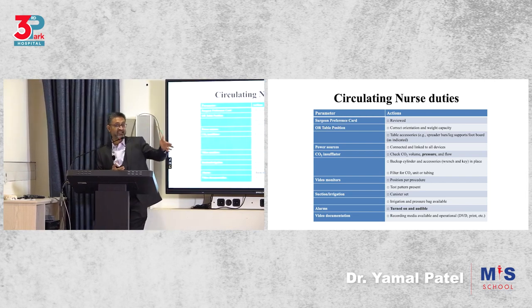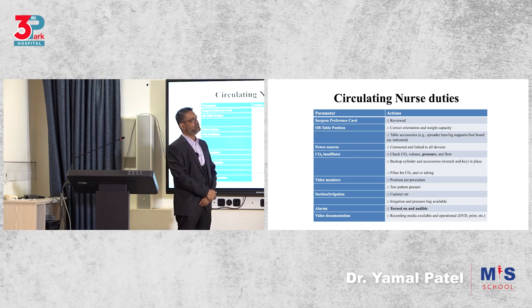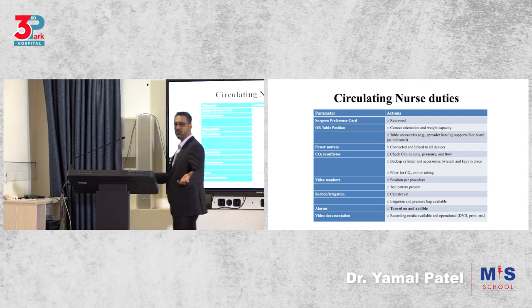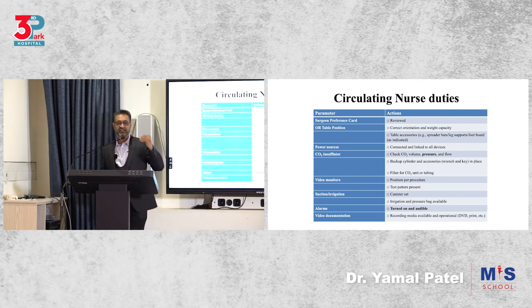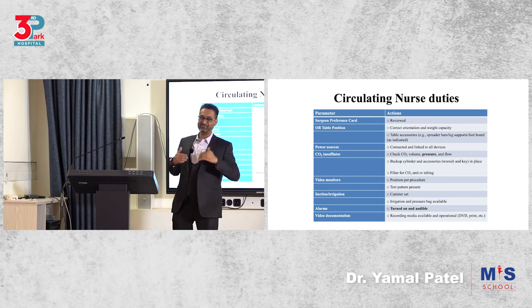Is the test pattern checked? It's like when I'm ready to start, that's when you turn it on, and then you're waiting 5 minutes for this machine to turn on and you're trying to find out what happened. Why is this machine not turning on? That's wrong. That's a waste of time. Your checklist should tell you, do it. I see people smiling. I know these things must be happening, all right? But you see what I mean?